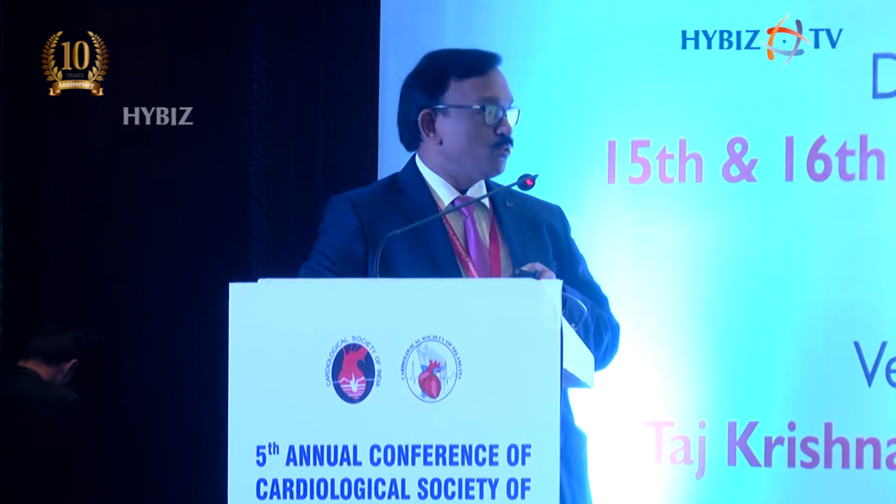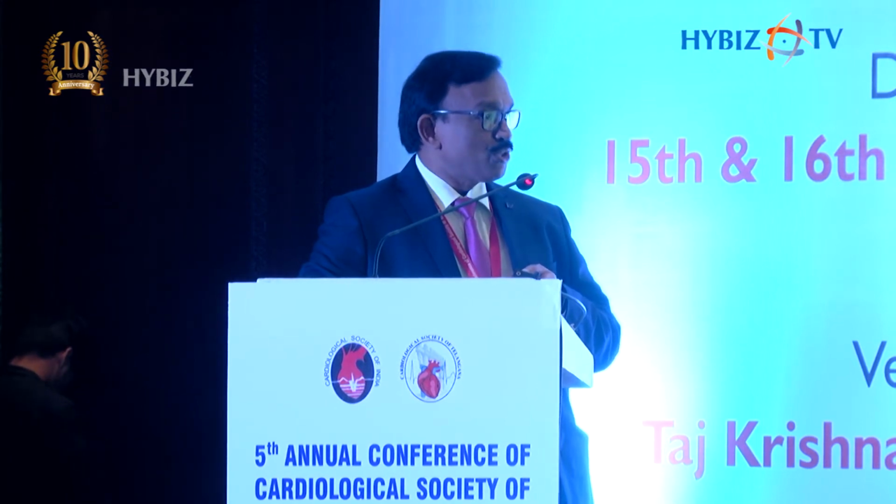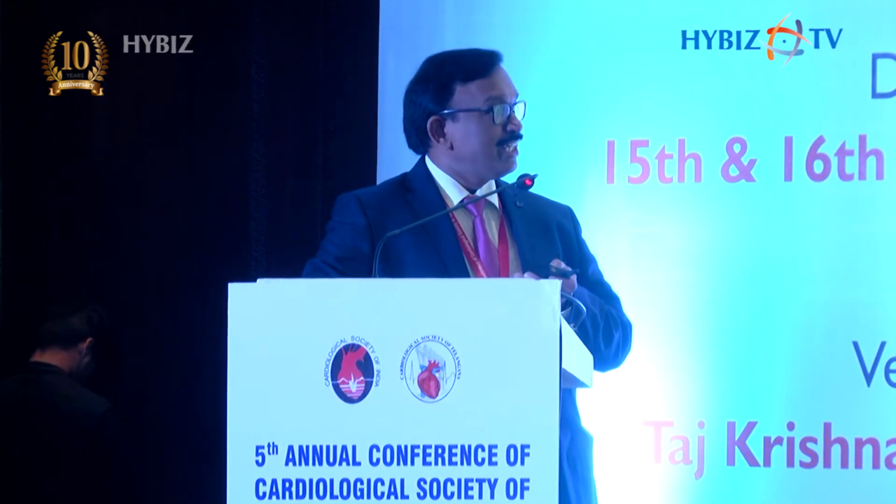a single value may not be the true representation of the actual blood pressure. This is probably the concept behind the emergence of ambulatory blood pressure monitoring. We know blood pressure is variable minute to minute, from morning to evening. There are various concepts, principles and factors that were discussed, and let us see how this ambulatory blood pressure monitoring really matters.